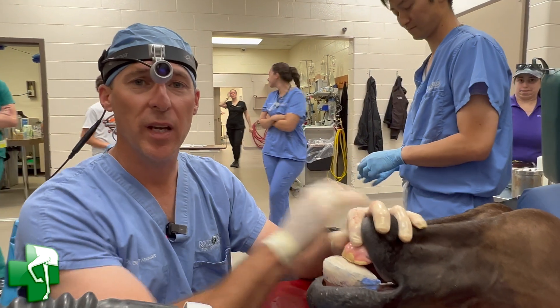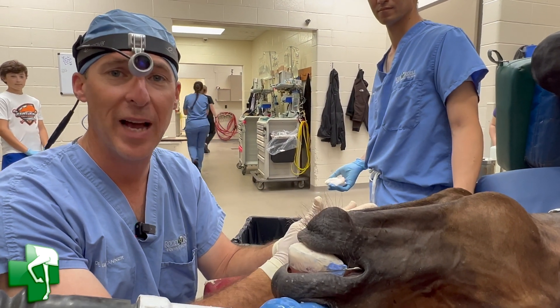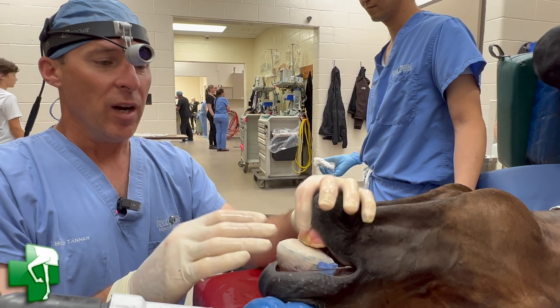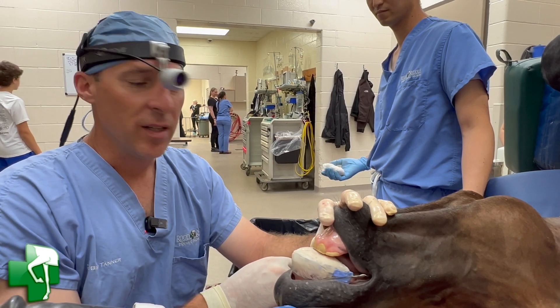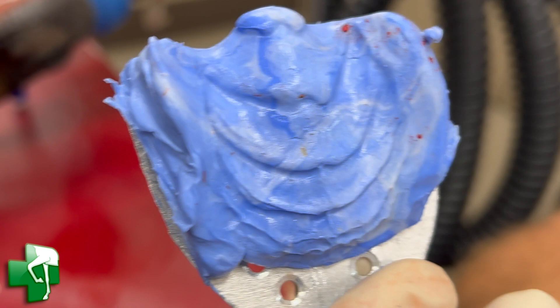Here we are post-operatively. Braces have been placed. There are wires now tied from the teeth in the back — the cheek teeth — to the teeth in the front on the incisors. This is the top jaw we're talking about. We've also applied an orthodontic device that began as an aluminum plate and has been covered in acrylic.